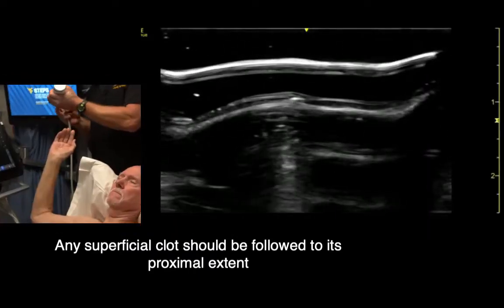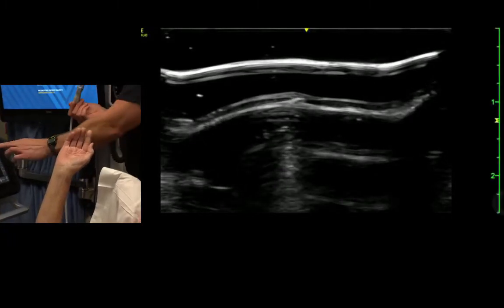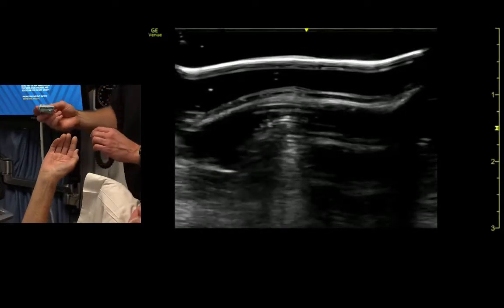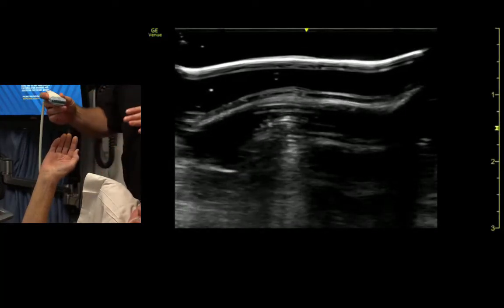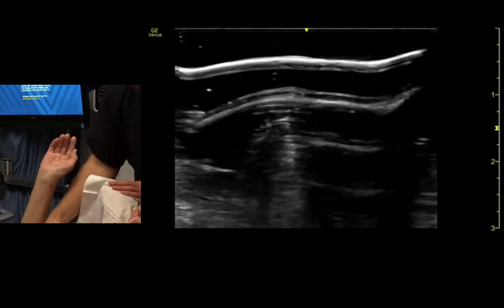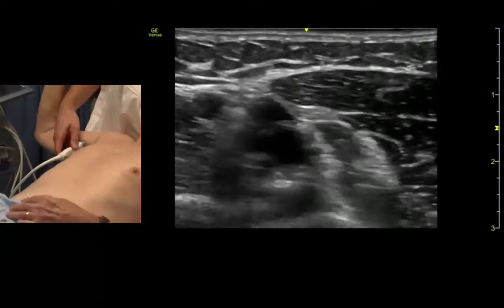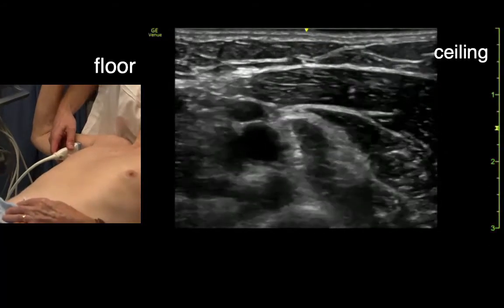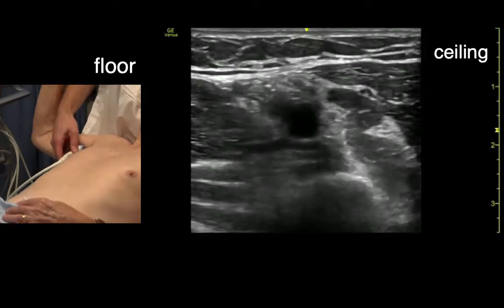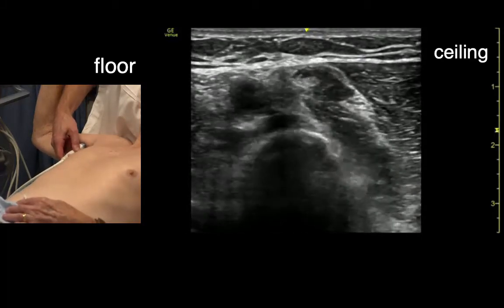We're just going to check out the structures in the axilla. Since I'm behind the patient, I'm going to keep the indicator away from me, because it's more away from me on the screen where I'm looking. In the axilla, we identify the axillary artery and vein. The vein is compressible. The artery is not.